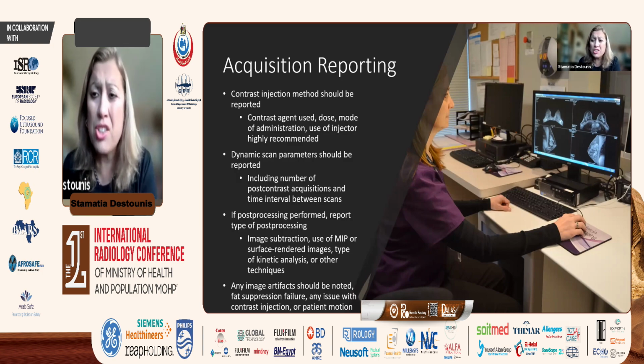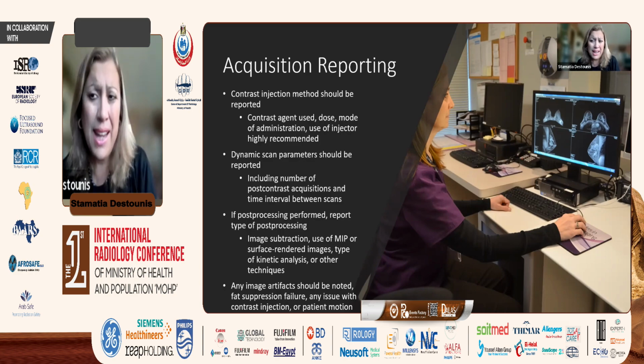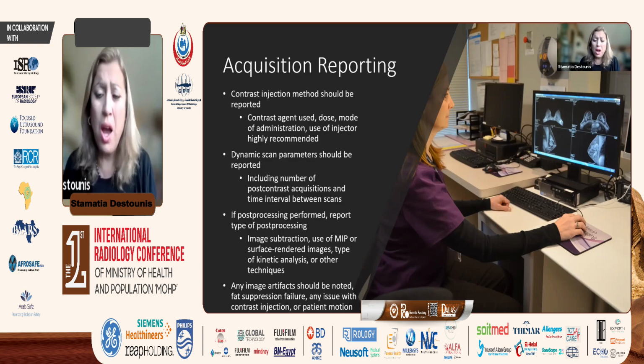Is it image subtraction, MIP, the maximum intensity projection, what surface type of rendering are we doing for our images, and what kinetic analysis? We have to be able to add that to our reporting.